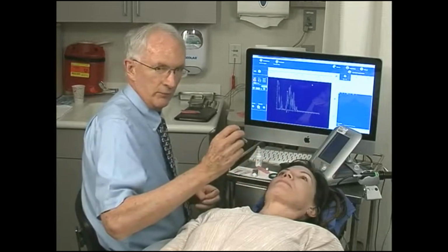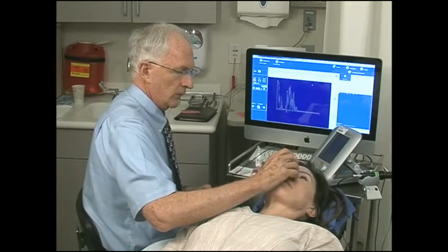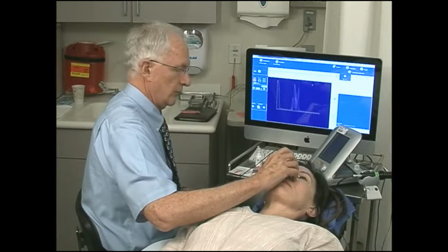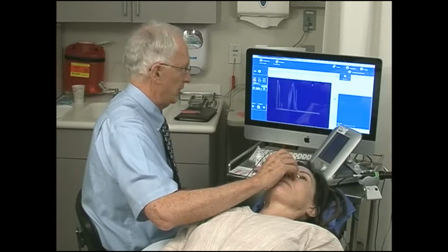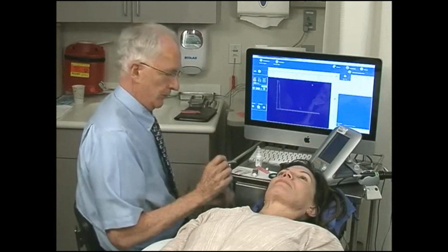You can also measure the nerve from the medial approach. If you have a hard time temporally, sometimes the way the nerve kinks in the orbit, it's hard to get a good display. So I will then place the probe medially and aim temporally to try to capture the nerve there. And sometimes you can get a better display as you aim across the nerve going this way. So sometimes I'll go back and forth. I'll do the temporal part first and then the nasal part, attempting to display the nerve. So here it's more difficult, so I had a better view by placing the probe temporally.